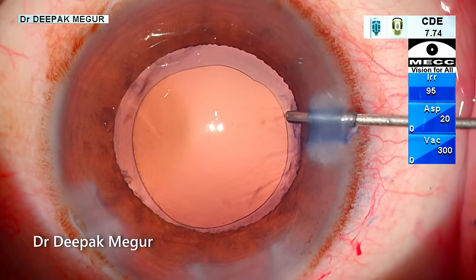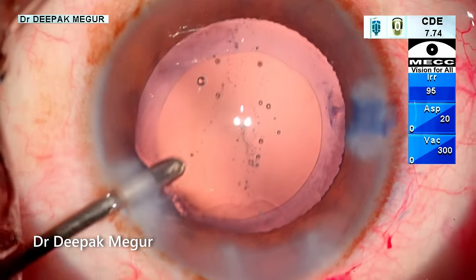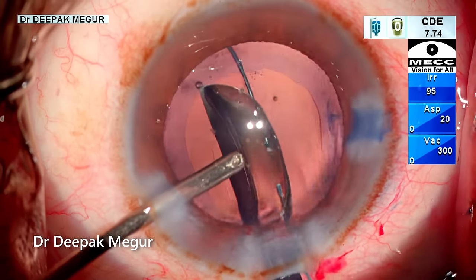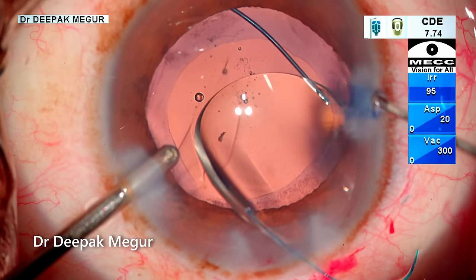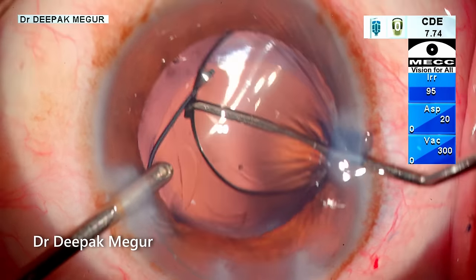I inject a little intracameral antibiotic into the capsule bag, followed by injection of viscoelastic which deepens the capsule bag and makes it ready for lens implantation. My assistant has already loaded the lens and I am going to implant a multi-piece hydrophobic lens. The distal haptic is gently negotiated into the bag, then the proximal haptic is gently dialed into the capsule bag. A commonly asked question is why I implant a multi-piece lens. In our practice we have different packages at different price ranges and patients choose based on their budget. The lens is a good value and performs well with regards to PCO rates. Many younger colleagues find it difficult to load and implant a multi-piece lens, but let me assure you that it's not.